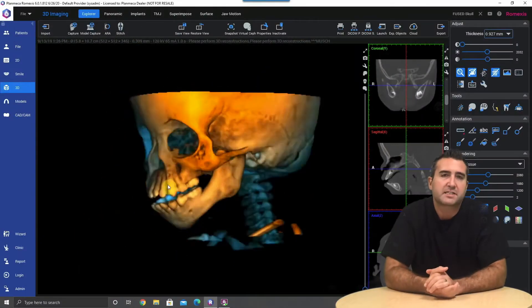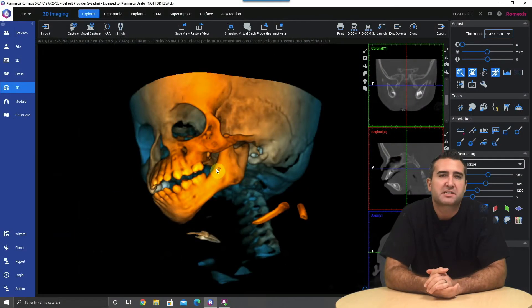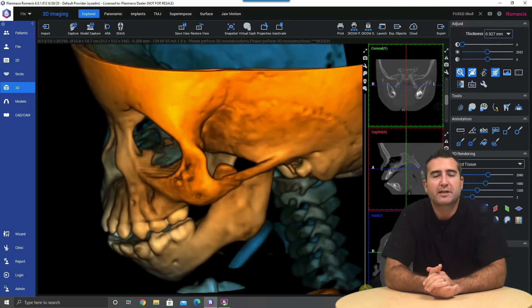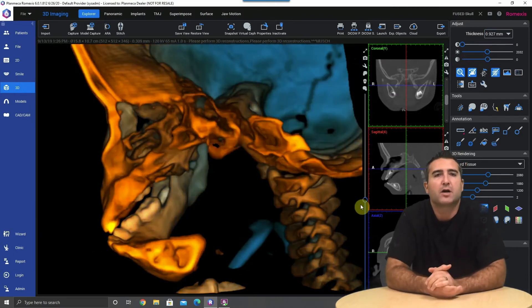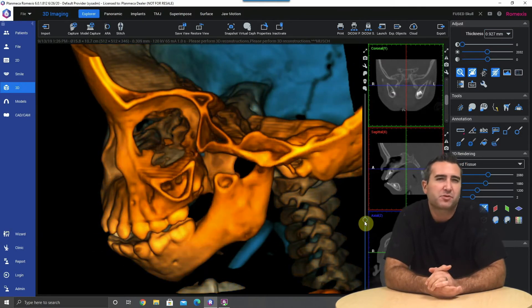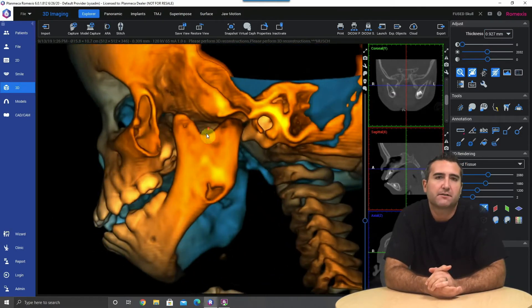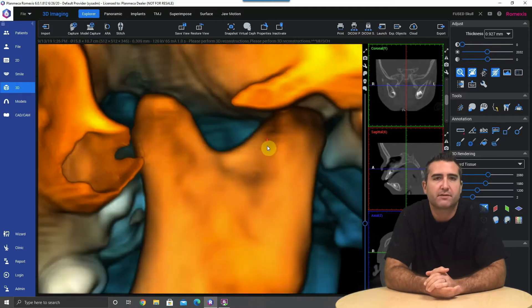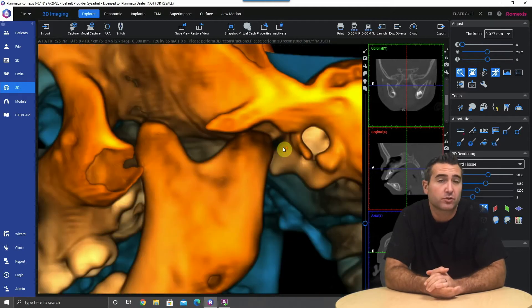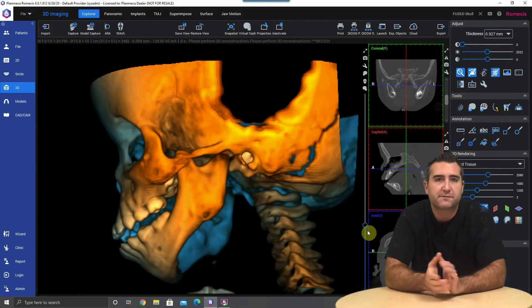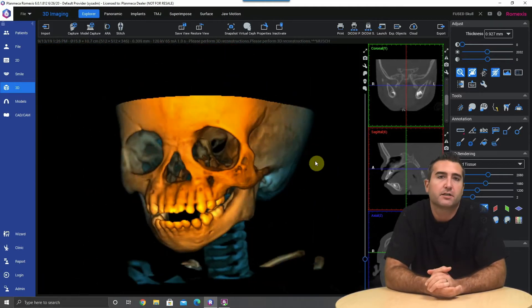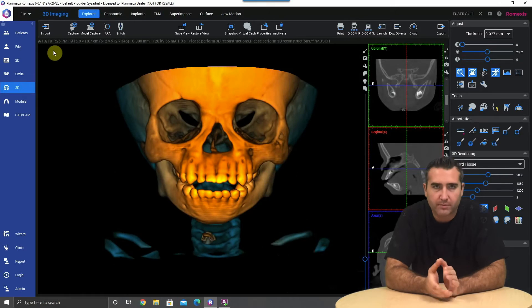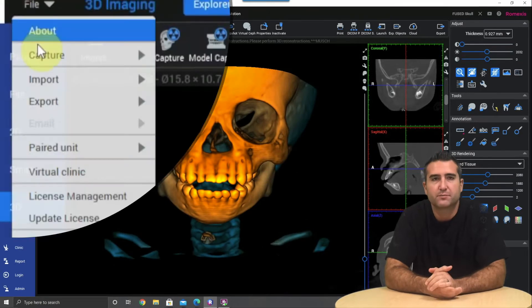Hey guys, welcome back to 60 seconds on Romexis. I'm flying solo today. We had a question about how do we export DICOMs as STL files. Here we have a little case — a six-year-old girl who has a fused left condyle to the articular eminence and can't open her mouth, so we need to print this model to look at it.